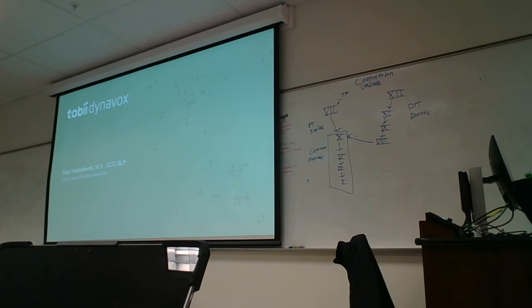I think we're ready to start. I'd like to introduce Matt from Tobii Dynavox. So he'll be doing a little bit formal presentation for you, and then also discussing the different vocabulary options that are available in the Tobii Dynavox products. Also show you different ways you can access the equipment, and then we'll give you time to do some hands-on work with the devices as well.